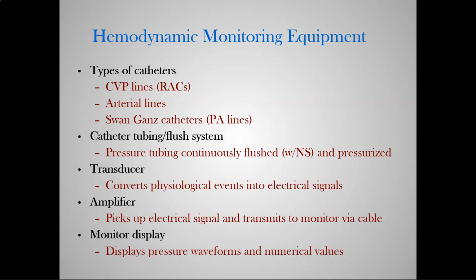Unless indicated by a physician that he would like something like heparin. Maybe you have a patient that has hypercoagulability. Well, in that particular instance, you may have a pulmonologist or intensivist, whatever the case, that may order heparin rather than normal saline to be used in that tubing. Obviously, we're going to be very conservative with our flushes. We are not bolus dosing our patient with heparin at will. We are simply trying to keep the line patent, open. That's the purpose of a flush.